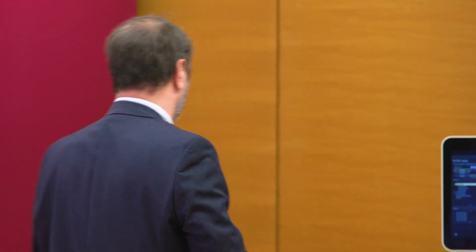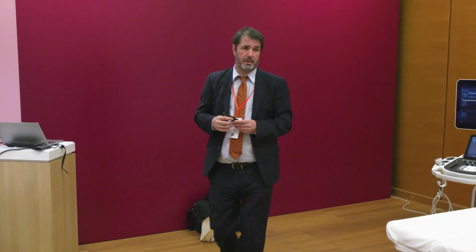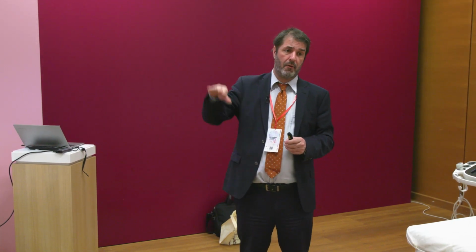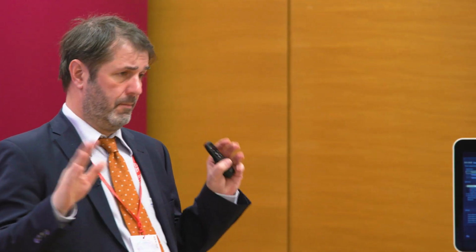All equipment you could also order with image fusion. And you don't even need the high-end system. Also, Philips have migrated from a high-end system to a mid-range system. It's available either for diagnostic, also for intervention. And with this system, there's only advantages.